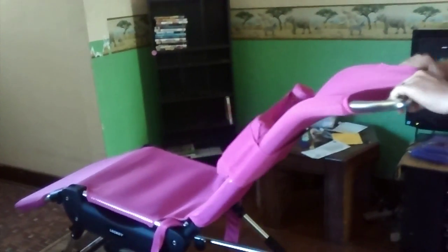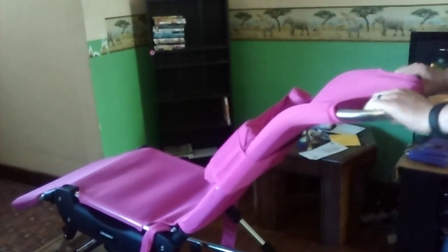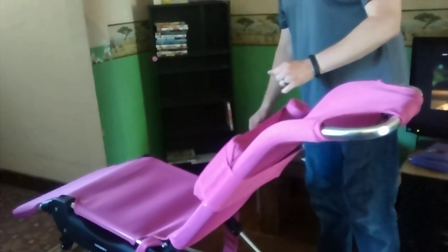But this is the angle that we were comfortable with trialing. Upright is a little too squeezed together.